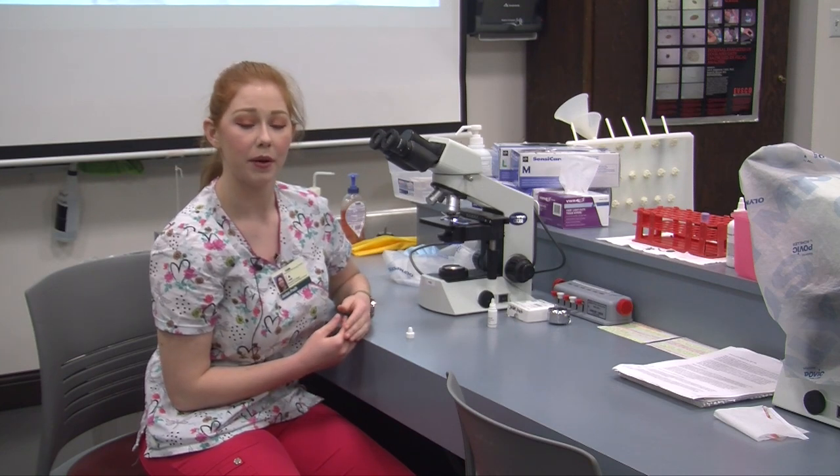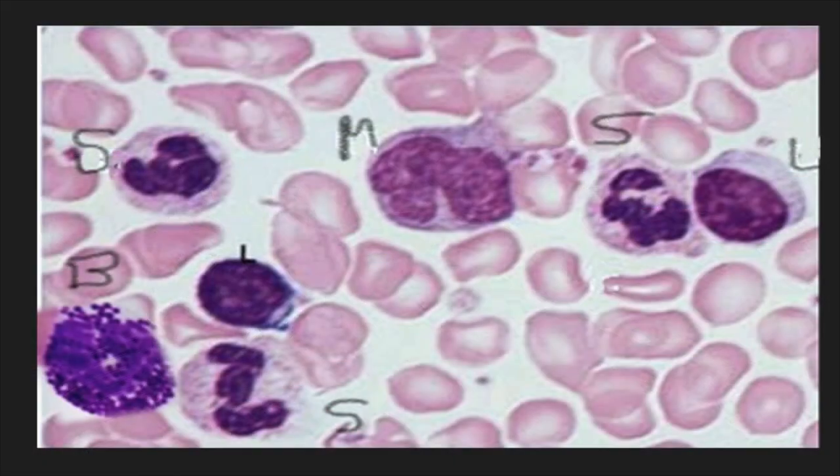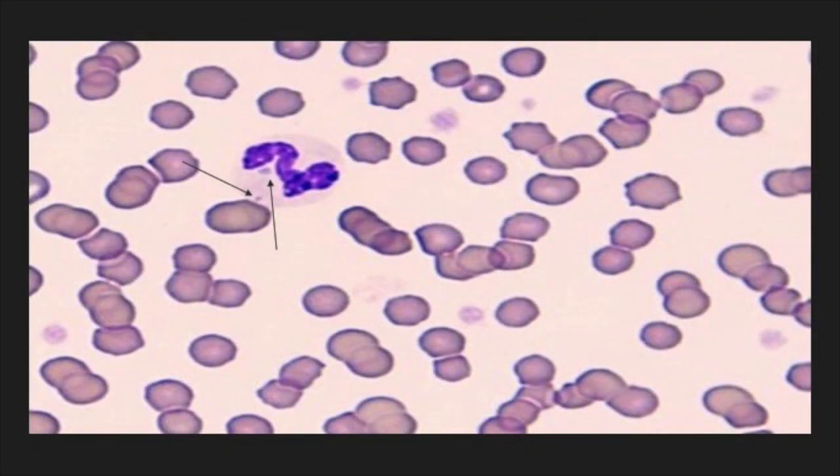Now we can visualize our white and red blood cells. The five white blood cells are known as neutrophils, lymphocytes, monocytes, eosinophils, and basophils. These are normal white blood cells that we should see under the microscope. We have to count them and note any abnormalities. This is a toxic neutrophil — we identify it as toxic because of those round angular bluish-colored bodies in the cell called Döhle bodies. These make a neutrophil toxic.